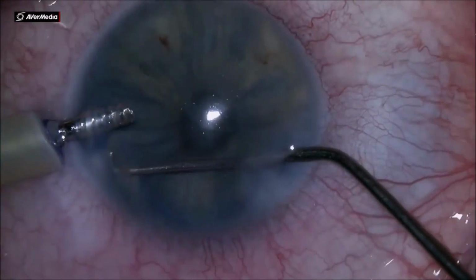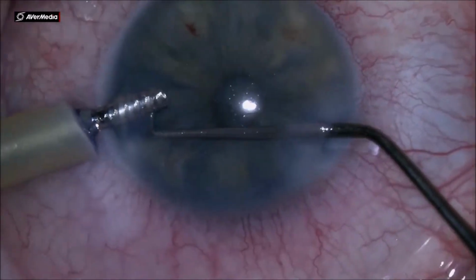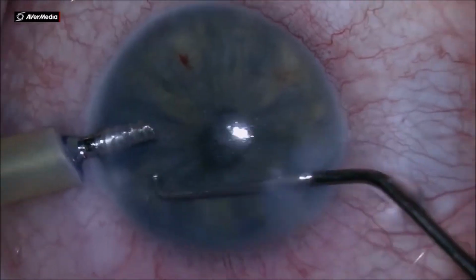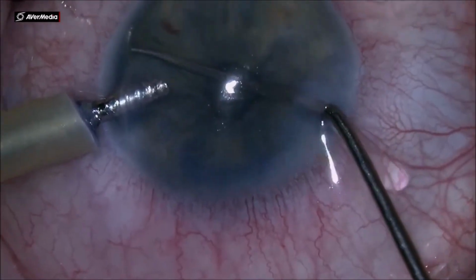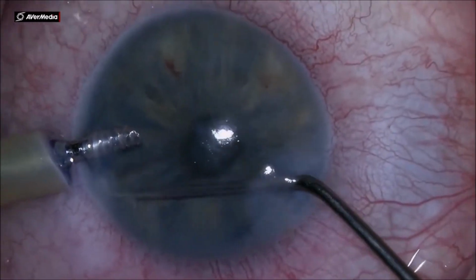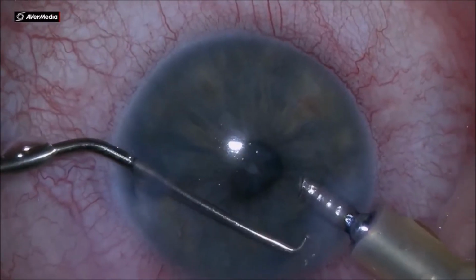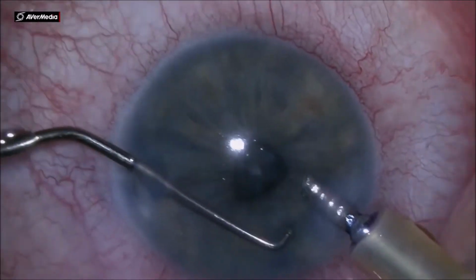And not only the lens, the cataract, when you remove the natural lens, we all know that the anterior posterior diameter is like 4.5 to 5 millimeters. So that being replaced by a 1 millimeter or less IOL will let the iris go backwards, and you have a larger anterior chamber, and in this closed angle glaucoma that will make a lot of difference.